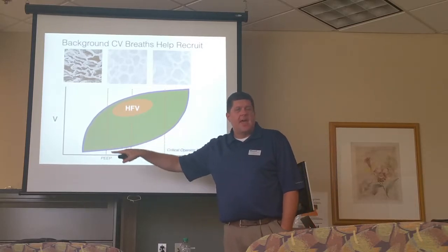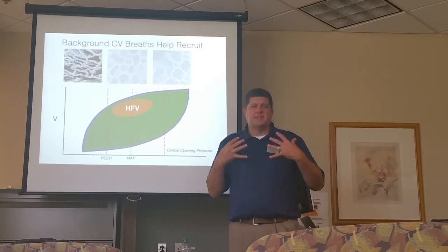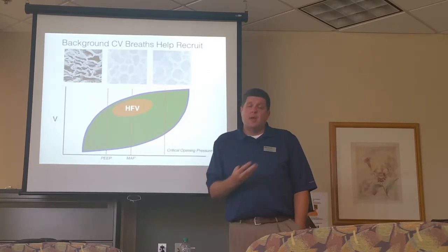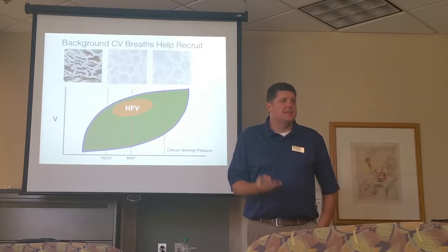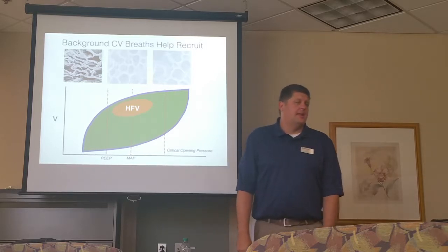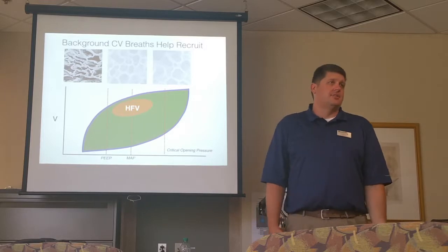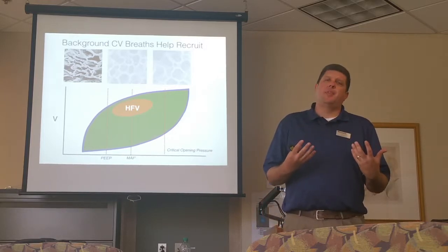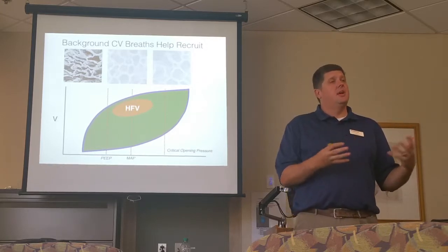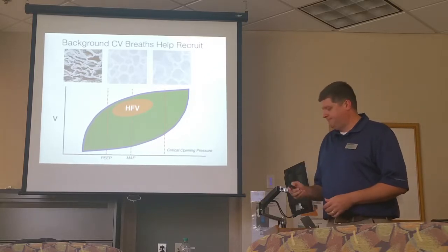That's the beauty of using the conventional ventilator. It provides the size, if you will, to get past this. So after suctioning or something, when the patient's decompensating a little bit, it's a great time to use the sigh breaths. Anytime the patient's having a spell where sats are falling, sigh breaths can help with that. And certainly if you have an x-ray and evidence of atelectasis, sigh breaths can help. So it's very, very useful and helpful.